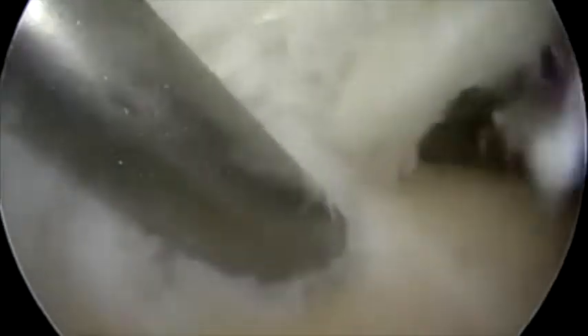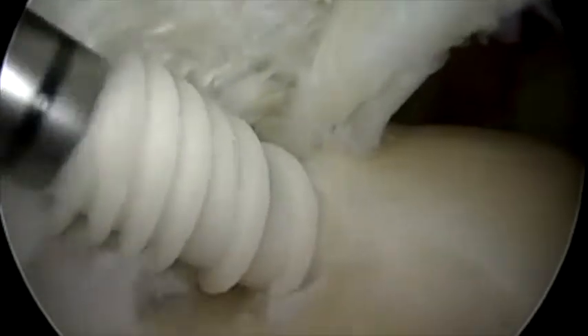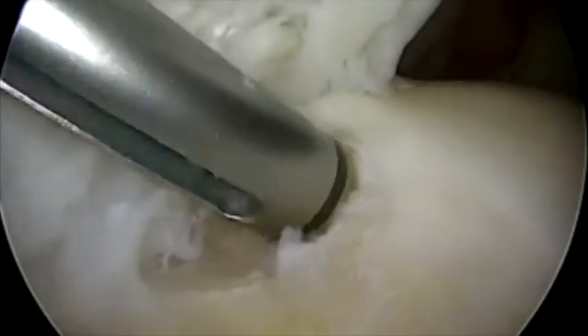The motorized shaver is inserted through the lateral portal and the greater tuberosity is abraded to a bleeding bony surface. A punch is used to create a pilot hole and a double loaded 4.5 mm anchor is placed posteriorly adjacent to the articular surface.